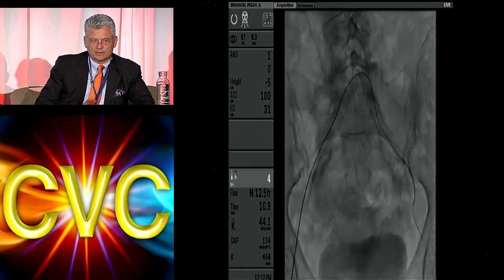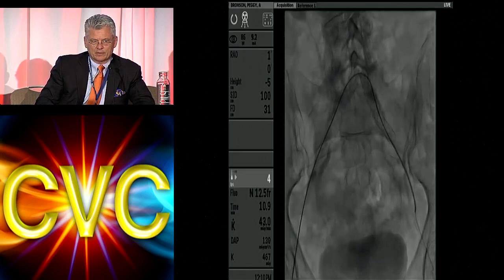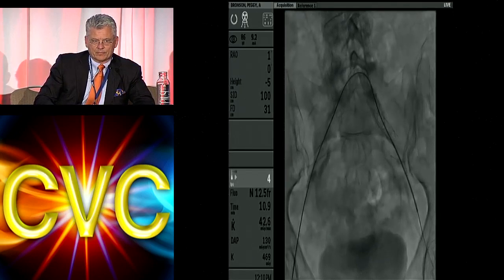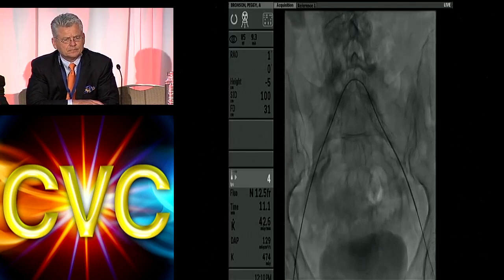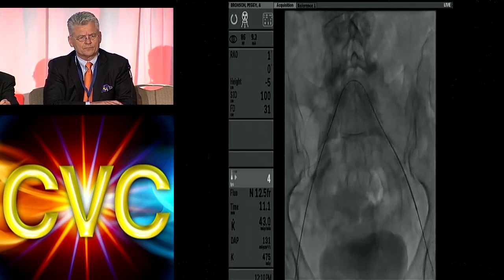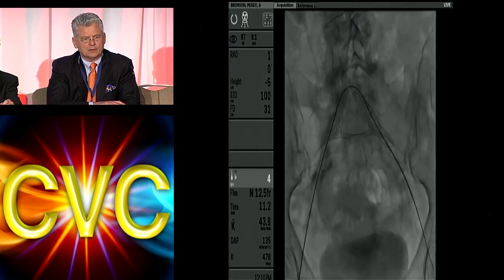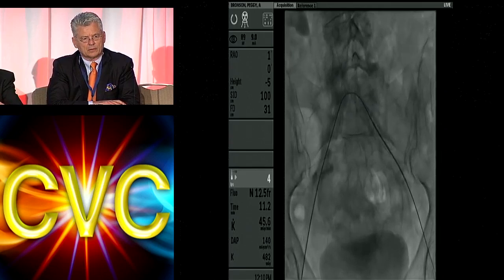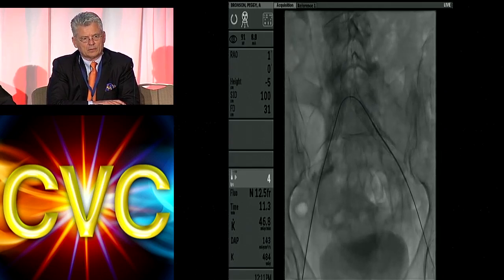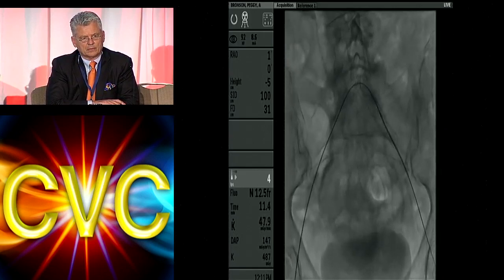And I think the problem is probably there, that I cannot move it at all. See, the whole aorta and iliac arteries move with that. Because of calcification, you can see it how nicely. And I had no trouble going over the stents to the other side because the stents are not sticking up into the aorta. They are level with the common iliac arteries.